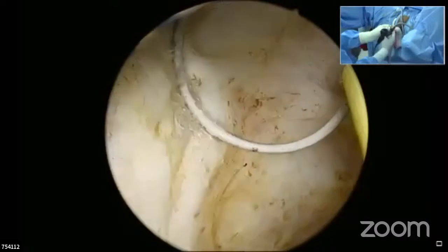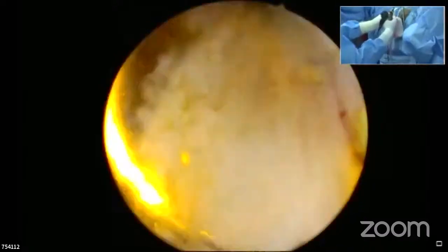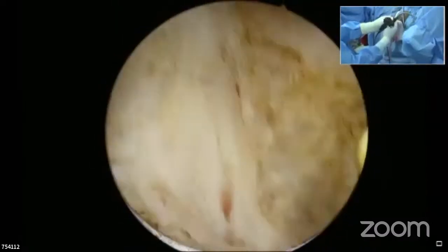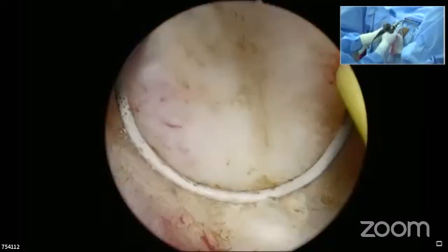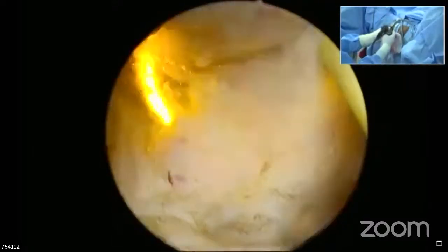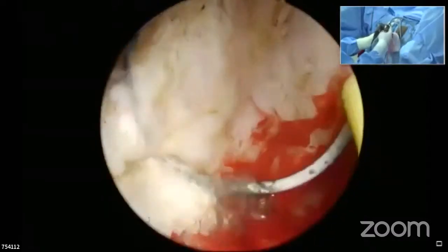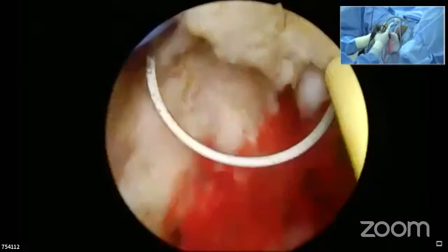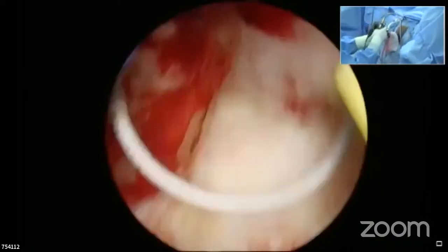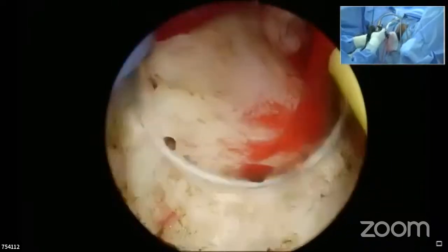Deepak, would you like to answer or shall I? I think if he's on a catheter, we need to clear the channel, and I would go ahead with the channel TURP for him. At least his catheter can go off. Yeah, I agree with you. You have to wait for 1 or 2 weeks because nobody wants to stay with the catheter for a long time. And if the size of the prostate is larger, better to go for channel TURP. There is no harm in that. And I would take the opportunity to do the bilateral subcapsular orchidectomy at the same time, talking to the patient. I agree with you 100%. If it is metastatic cancer prostate, it will be kinder to do a bilateral orchidectomy.